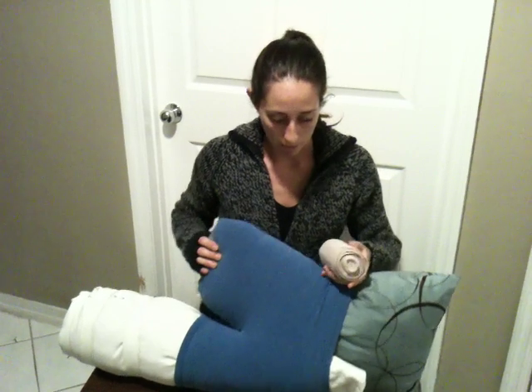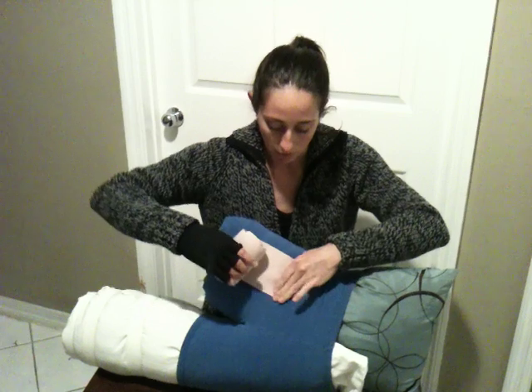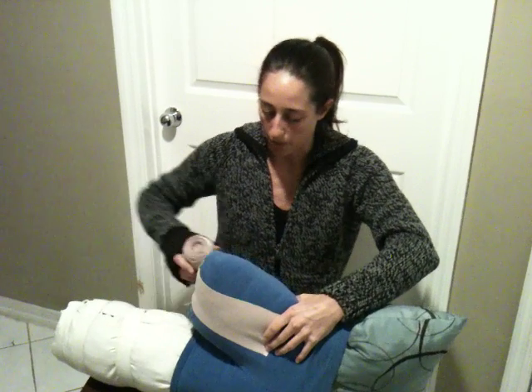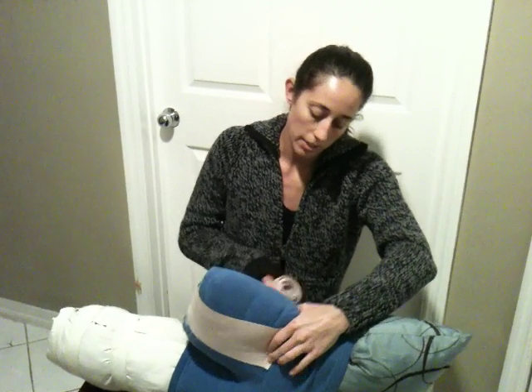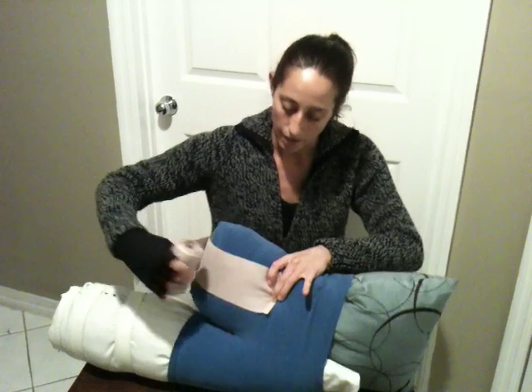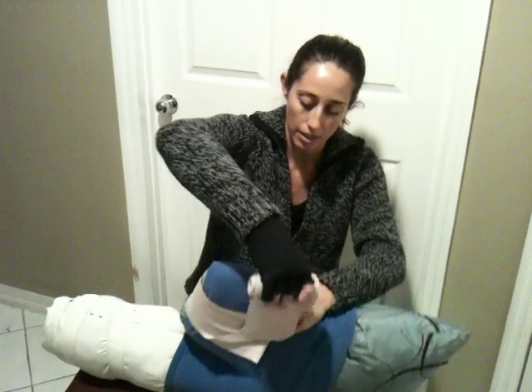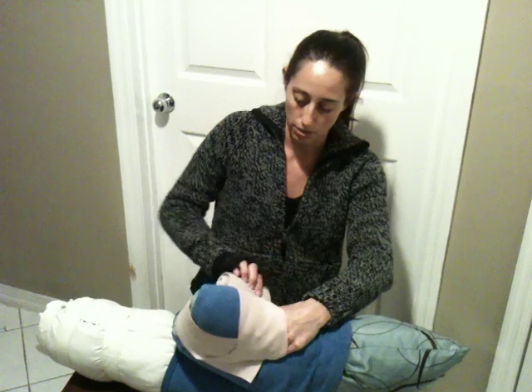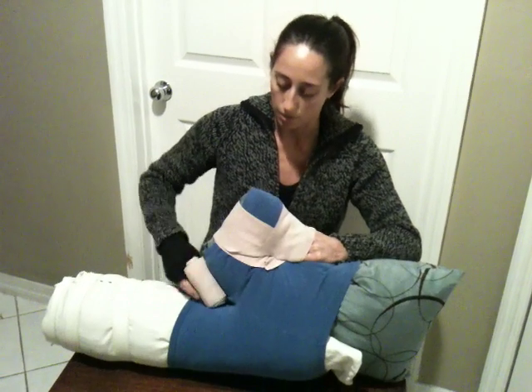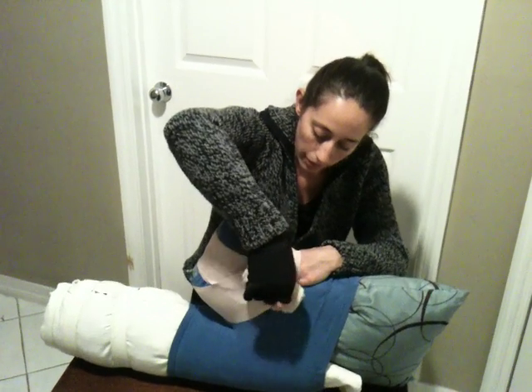I'm going to demonstrate the ace wrap for the above-knee amputation on my model. We're going to start with the ace wrap right at the inguinal line, come around the bottom, take it all the way up to the crease, come back around, and turn towards the lateral part of the leg. This one is going to anchor both sides of what we just put on.